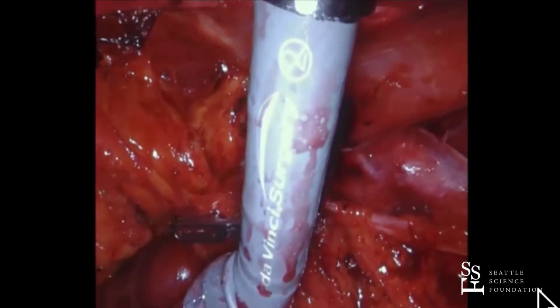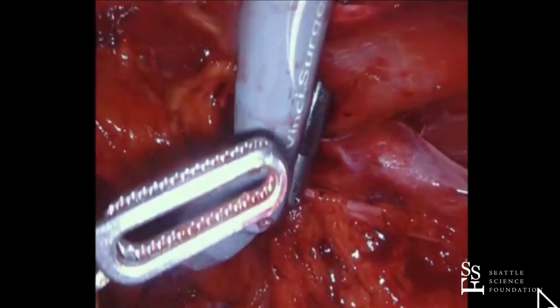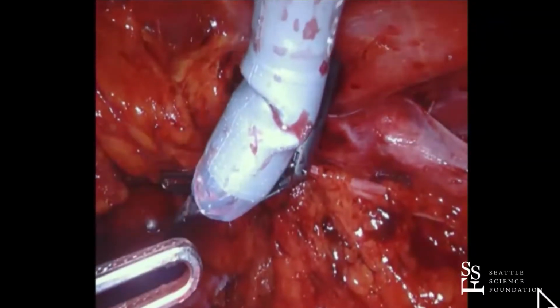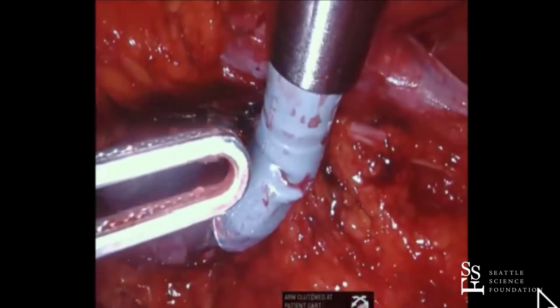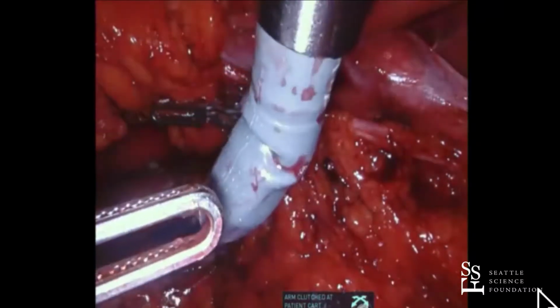Okay, now the other thing I want to check is the ports. You see how this port's almost all the way out? We're going to be exchanging instruments in there, so now we want to bring this port in, Brando, okay? This is something you want to check before warm ischemia. Go ahead. In, and back in some more, Brando. In some more, and then back it up. Burp it. Burp it up. Burp it. Good, right there.